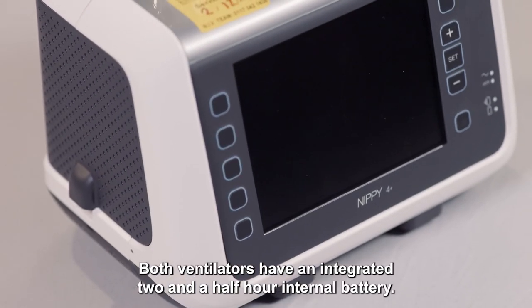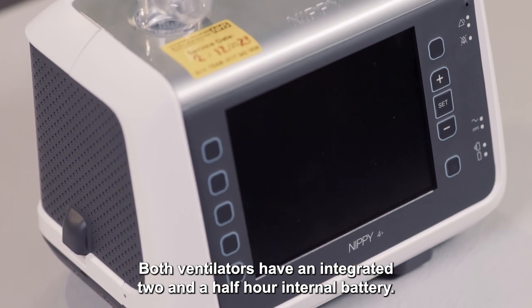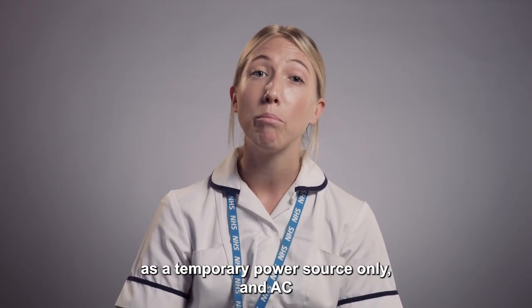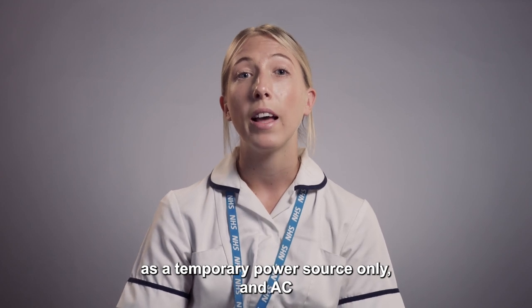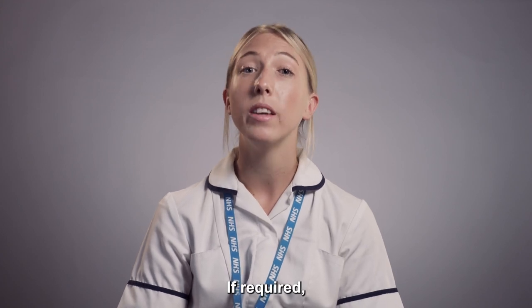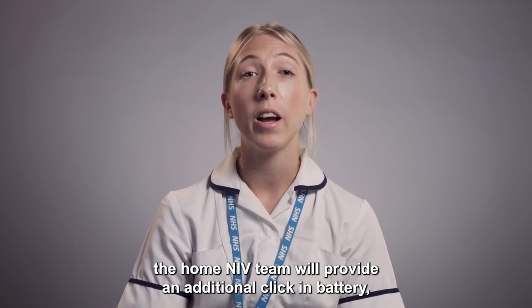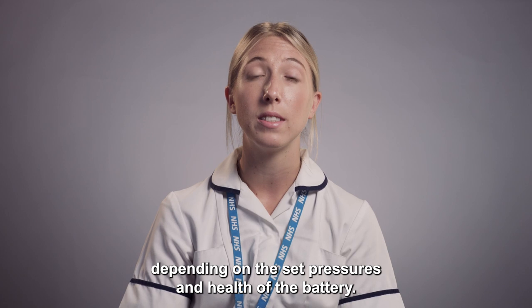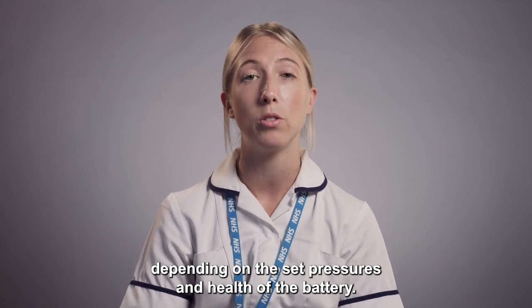Both ventilators have an integrated two and a half hour internal battery. This is for use as a temporary power source only and AC mains power should always be used when available. If required, the home NIV team will provide an additional click-in battery, offering an extra six and a half hours of power depending on the set pressures and health of the battery.